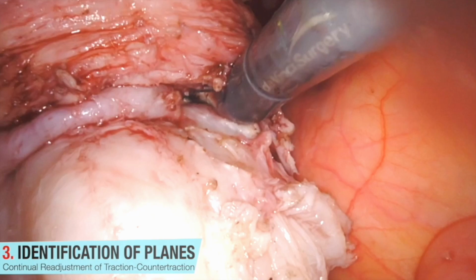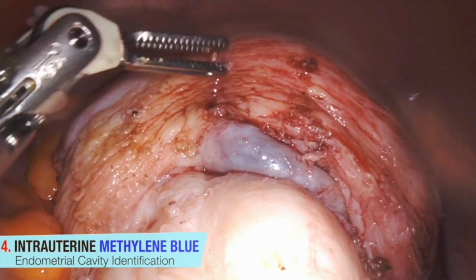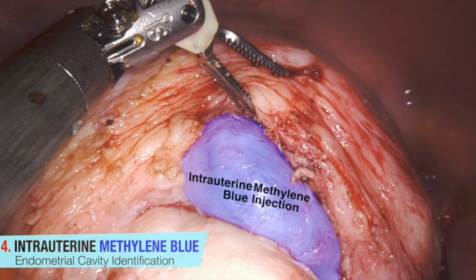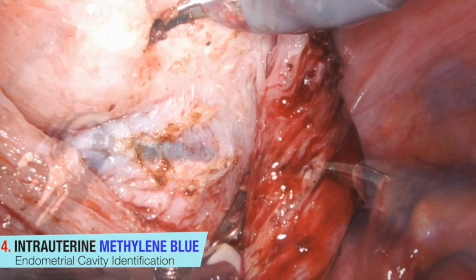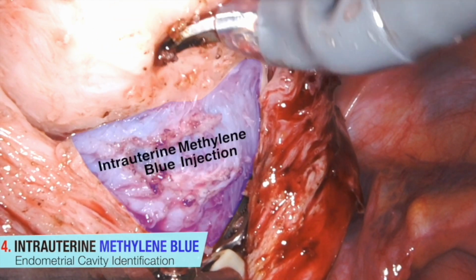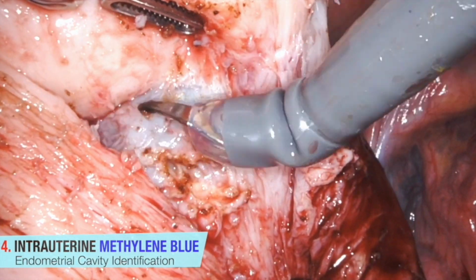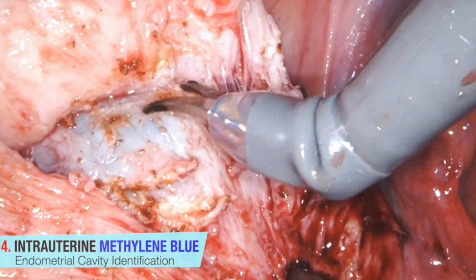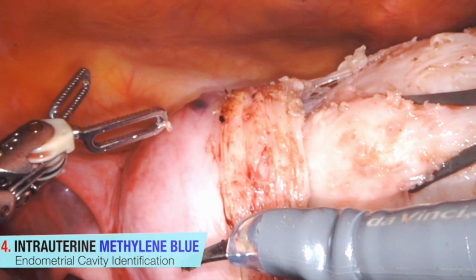When approaching the suspected endometrial cavity, blunt dissection was utilized to avoid trauma or thermal damage to the endometrium. Injection of methylene blue through the uterine manipulator can help with identification of the uterine cavity, facilitate dissection, and reveal inadvertent endometrial entry. Instillation of methylene blue is used periodically throughout the case to help highlight the endometrial cavity. Careful blunt and sharp dissection is used to remove the fibroid.